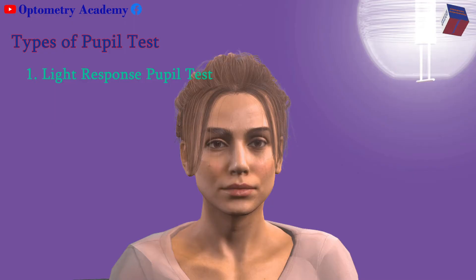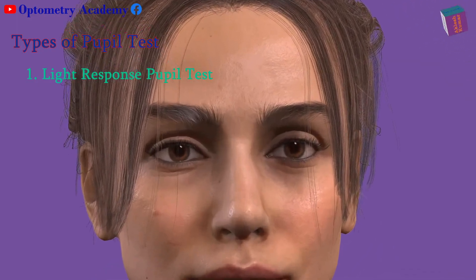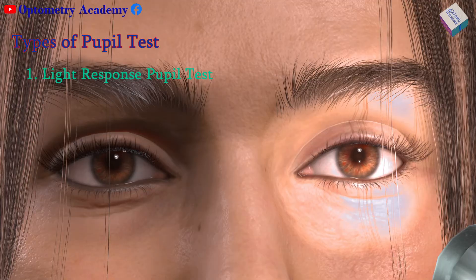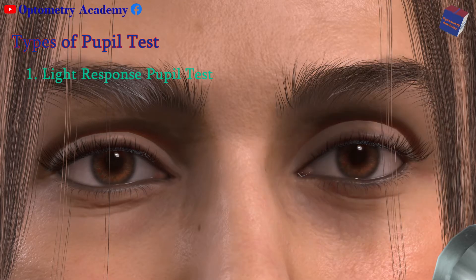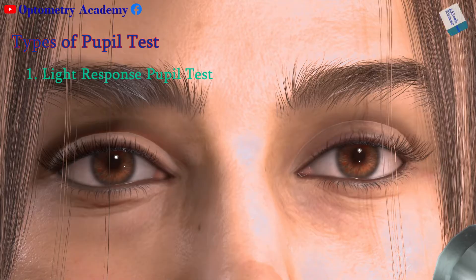Light response pupil test: This test evaluates the reflex that regulates pupil size in reaction to light. After dimming the lights, the doctor will ask you to look at a distant object. A beam of light will shine into your eyes from either side. Your doctor will examine the pupils closely to see if they constrict in reaction to light, noting their size and shape.